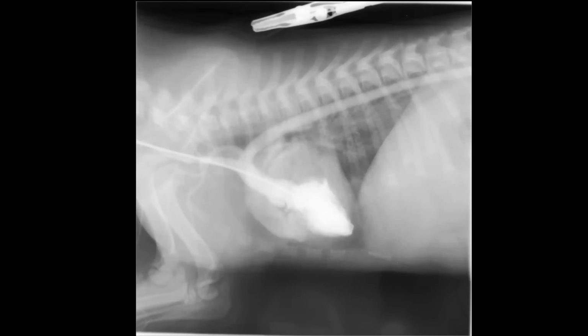Okay. So here in the old days, again, we used to contrast these. We put a catheter down the carotid artery. The catheter ends up in the left ventricle. We inject this white iodinated contrast material. When the left ventricle then contracts, the majority of it goes out where it's supposed to, into the aorta, but some of it goes right through this little hole right here. And that little hole is the VSD. So some of that blood and that contrast material is now going to fill the right side of the heart as well. This is the right ventricle. So that little communication right there is the VSD.